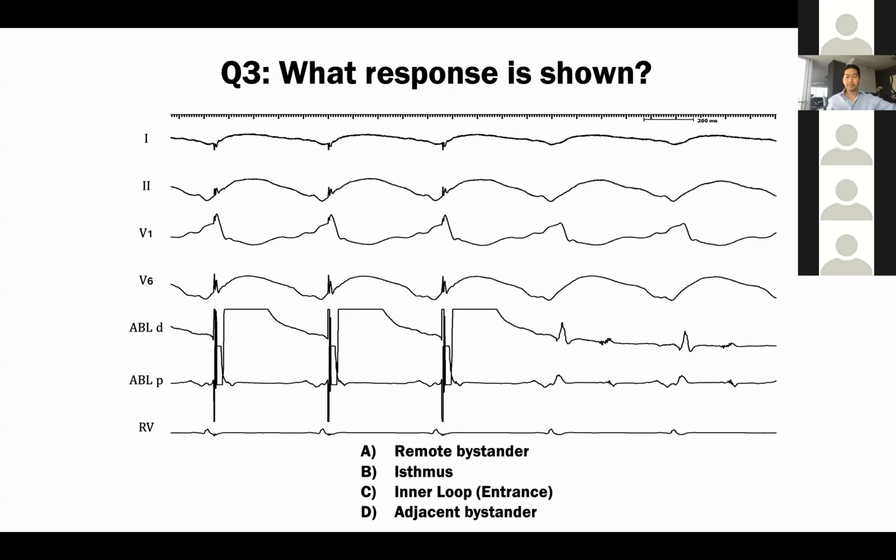Okay. So this is where using your neighbors is really helpful. How do I know if I've captured this component? Well, look at proximal. You've got this really nice little sharp thing that then scoops down and gives you this negative component.